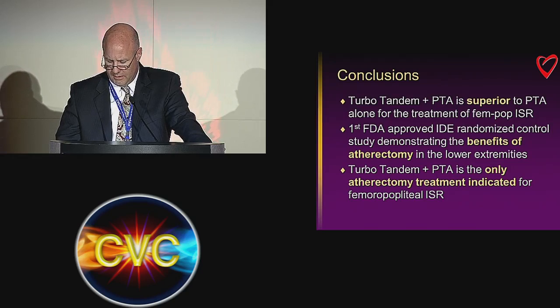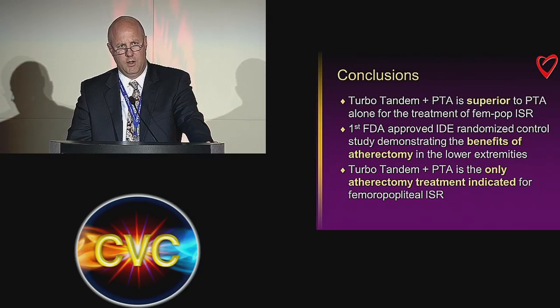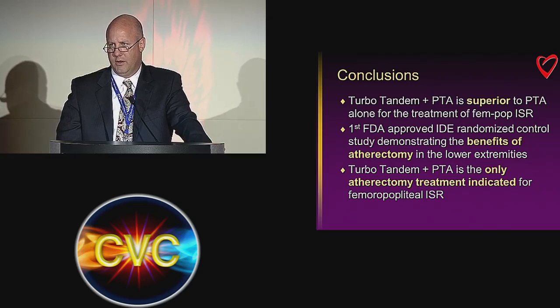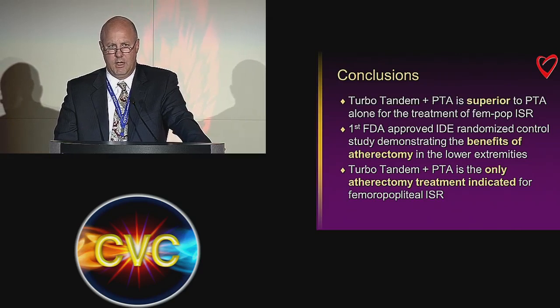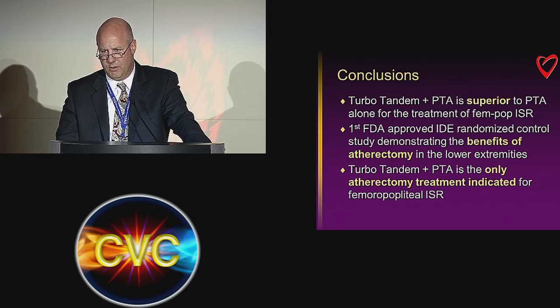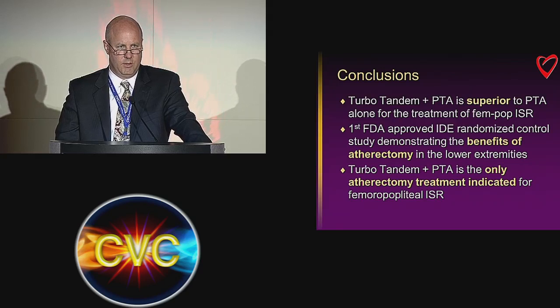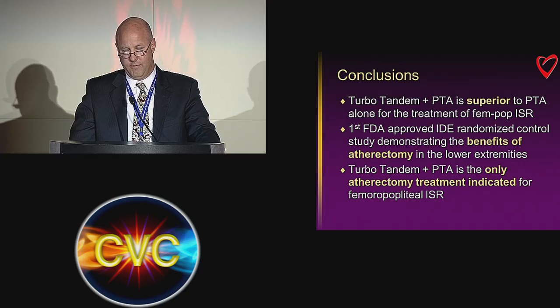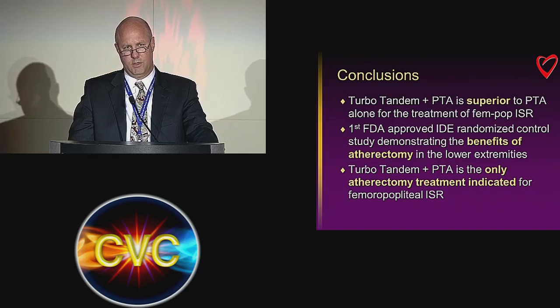And I think a couple other comments, in conclusion, is that we now have level 1 evidence on how to treat in-stent restenosis. We're beginning to define a treatment paradigm. As I mentioned earlier this morning, a lot of the data up until this point has been anecdotal, based on what individual operators do. We also now have approval of the Viabahn for in-stent restenosis.